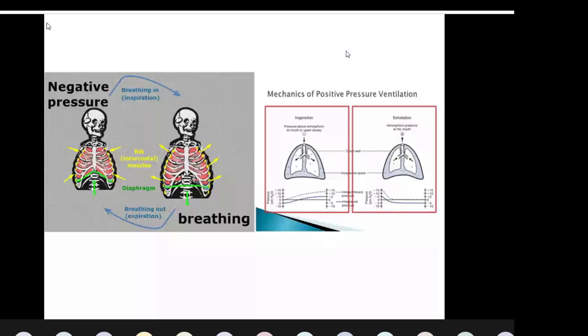So basically, there's a trigger. What makes me initiate a respiration? That's the trigger. There's a target. How much I should inspire before I should stop inspiration? And there's a cycle. At the end of inspiration, whatever has been decided, I will start to exhale. Baseline pressure from which I can again start from the inspiration trigger.